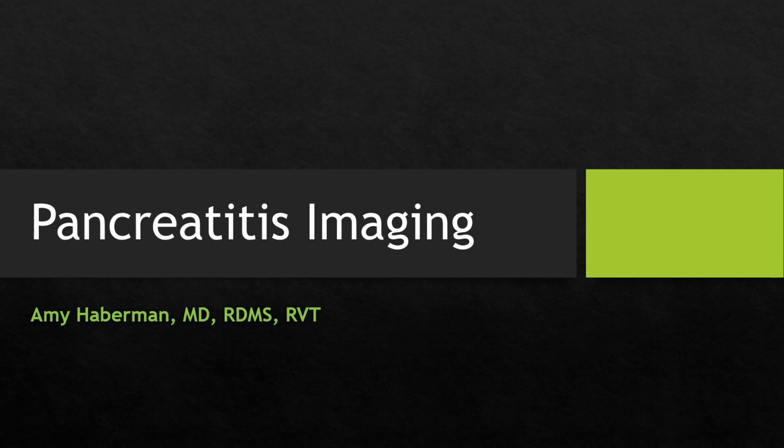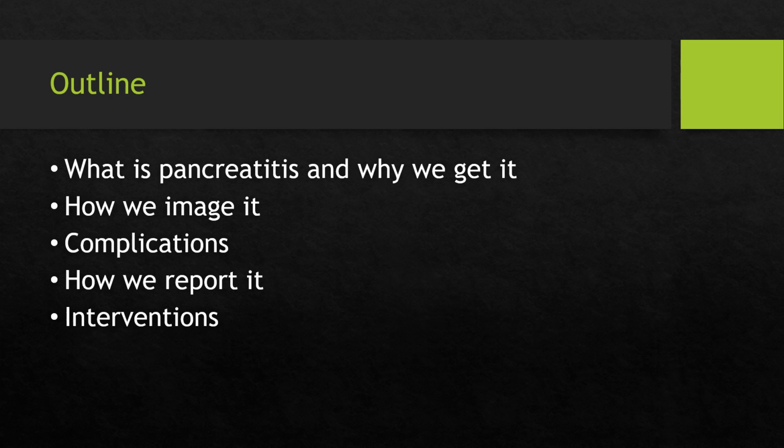Welcome, this is Pancreatitis Imaging. So here are the things we're going to cover. What is pancreatitis and why we get it, how we image it, complications, how we report it, and what they do about it.